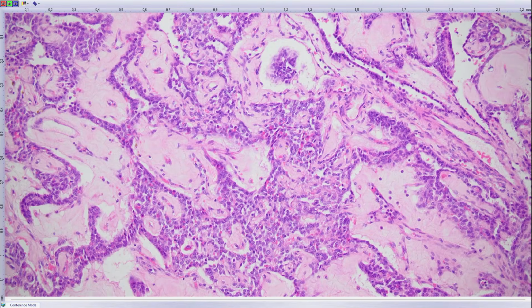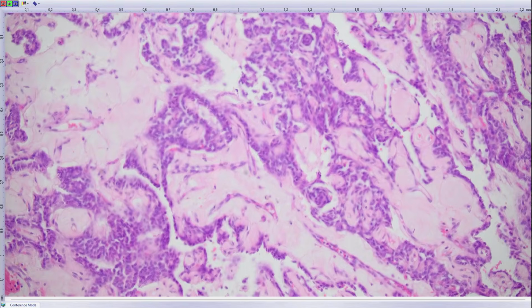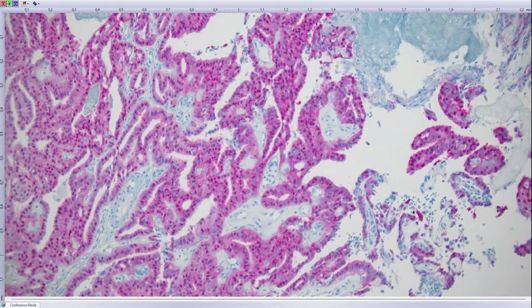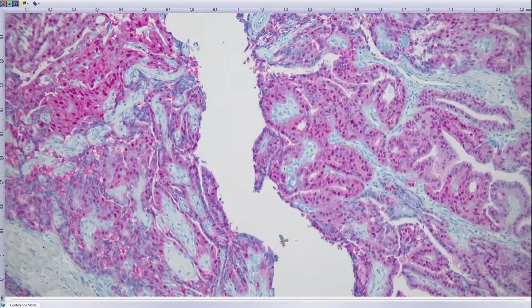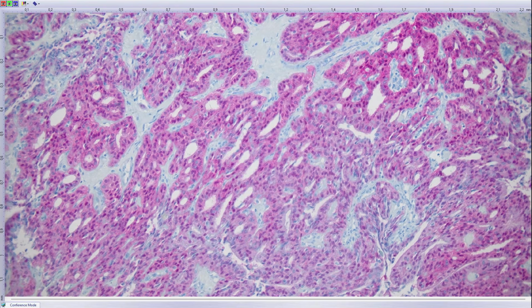It's always non-encapsulated. Of great help is when you stain these lesions with beta-catenin staining, which are always and must be beta-catenin positive. You see nuclear positivity. And this special type of carcinoma of the thyroid is now named morular cribriform carcinoma of the thyroid, which is a rare type of lesion described in the 90s. And sometimes it is associated with syndromes, especially Gardner syndrome or other syndromes.